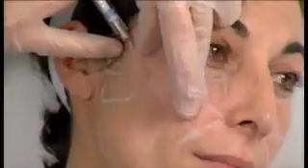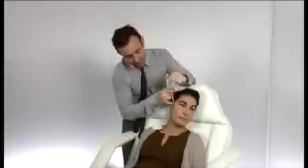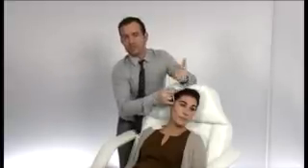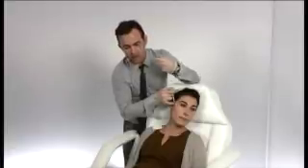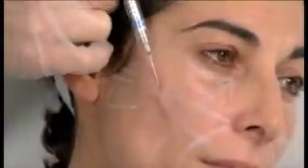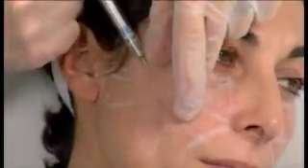It appears that you're in the immediate subcutis here, correct? Yeah, I'm actually scraping against the dermis. I can't really get into the actual dermis with my cannula because it's a blunt tip. So the path of least resistance is the sub-Q, obviously, but I try to be as superficial as possible to create thickness of the skin, new collagenesis in the deep dermis. Patients often mind this more than the needle, but when you tell them that they won't bruise, they're very happy to do it.